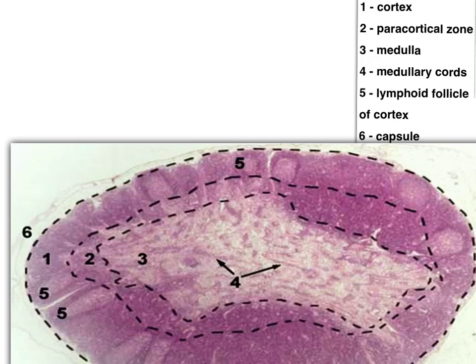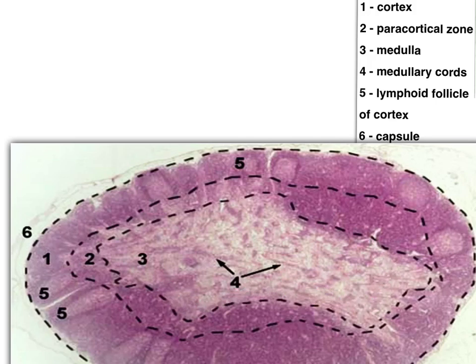Area 1 is the cortex. Area 2 is the area between the cortex and the medulla — the deep part of the cortex — which is the paracortical zone containing T lymphocytes coming from the thymus through the post-capillary venules. Area 3 is the medulla. Number 4 structures are the medullary cords. Number 5 are the lymphatic follicles with germinal centers. Number 6 is the capsule of the lymph node.